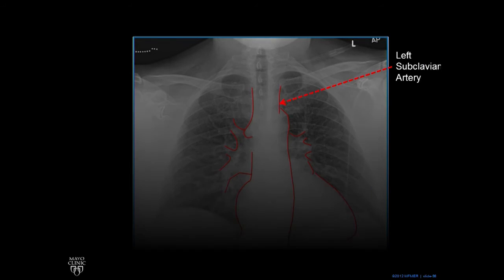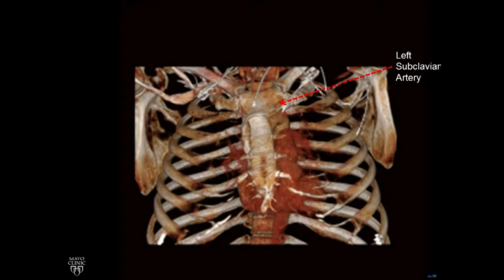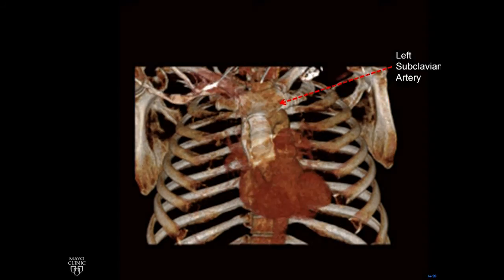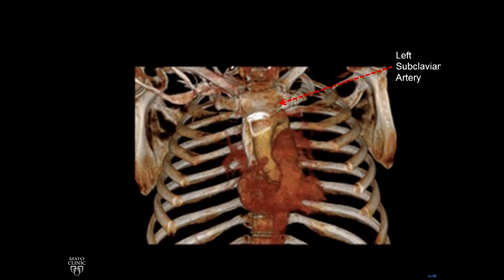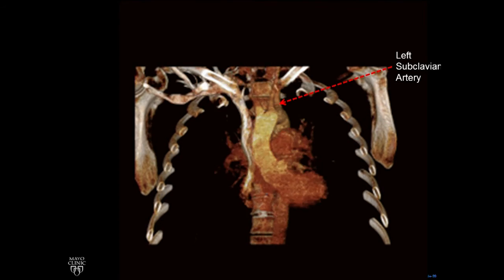So if we go to our CT scan, we peel away and there's the aorta, the aortic arch, three great vessels, and the one that's furthest to the left that makes a border with the lungs is the left subclavian artery. It supplies the left arm, the left upper extremity.